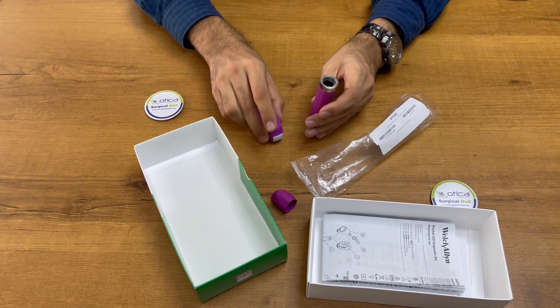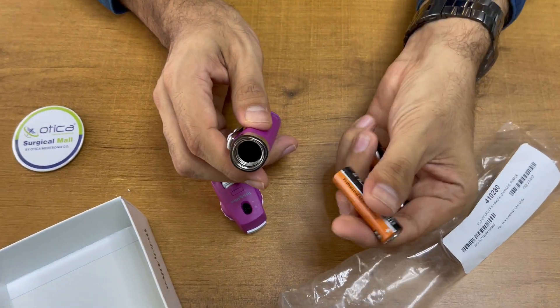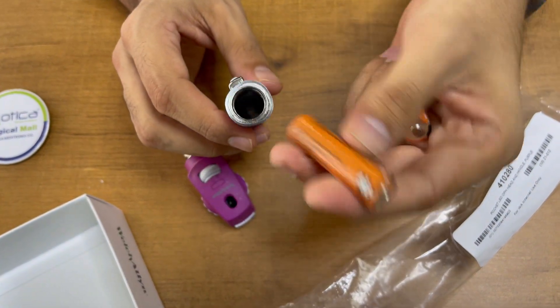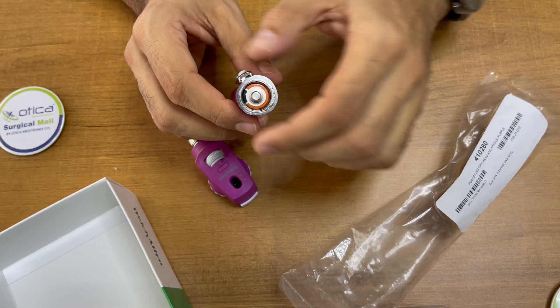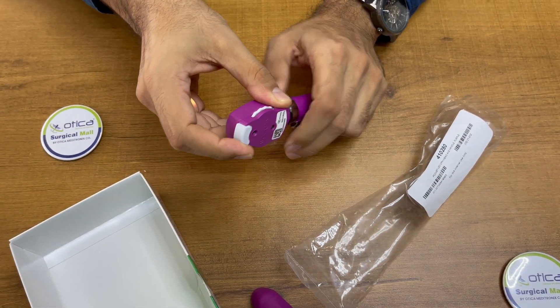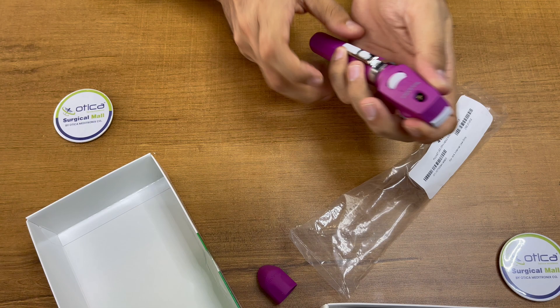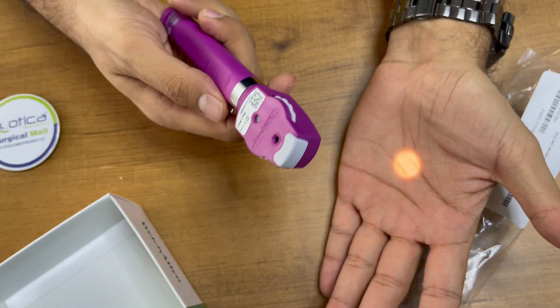Now we need to open this to check. We need to apply two double-A batteries. Keep the negative side in the deep end and the positive side on the upper side. Close it properly — as it's a new machine, you need to apply a bit of force. You can see it is now on.